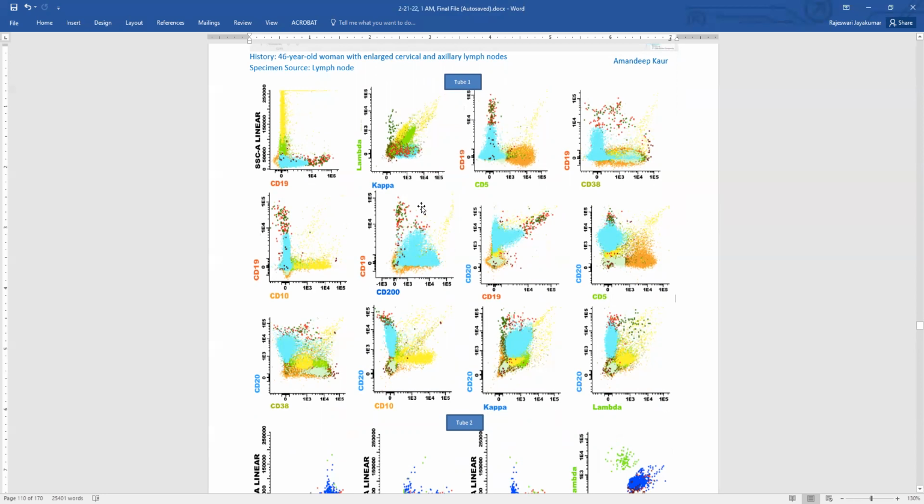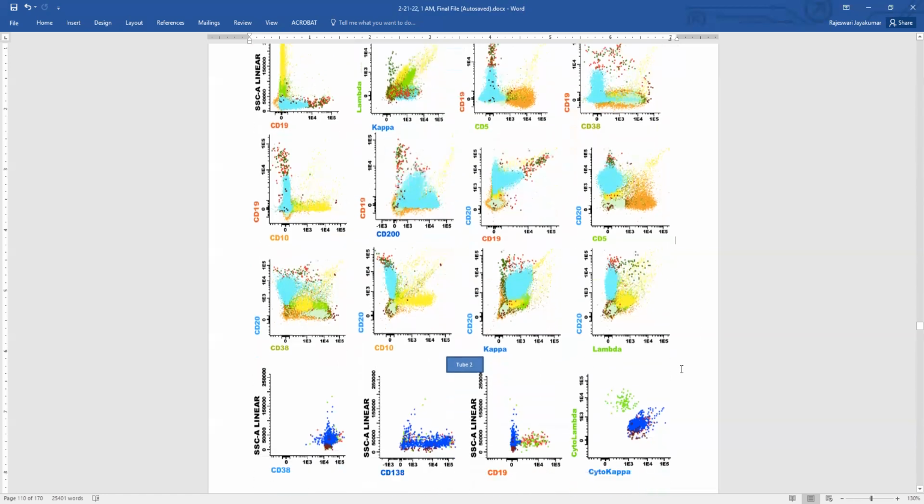Here we can nicely see them; here it is kind of buried behind the polyclonal kappa cells. Here you can see them clearly. So the normal background polyclonal kappa cells are here that are red, and your aqua population is also kappa. And the lambda positive cells are green here, and you don't see anything in green in that aqua population.